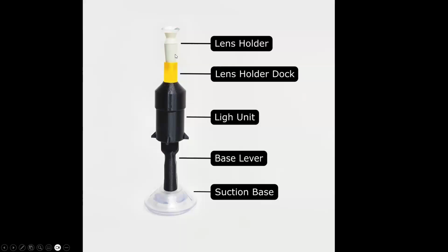Because of the difficulty in having to use the plunger as well, some people recommend that you use the lens holder.